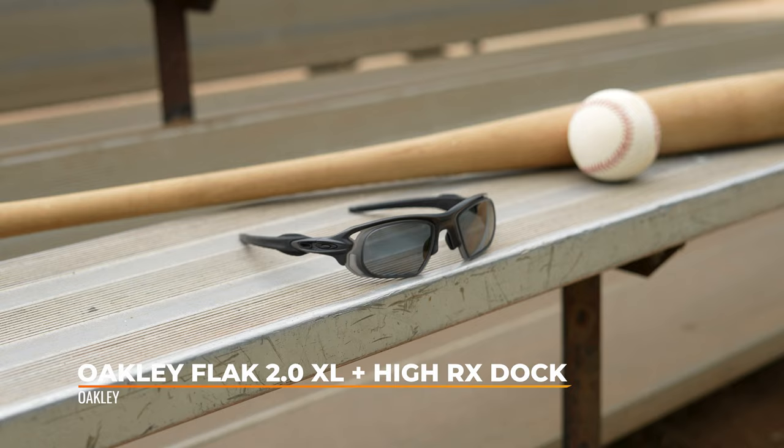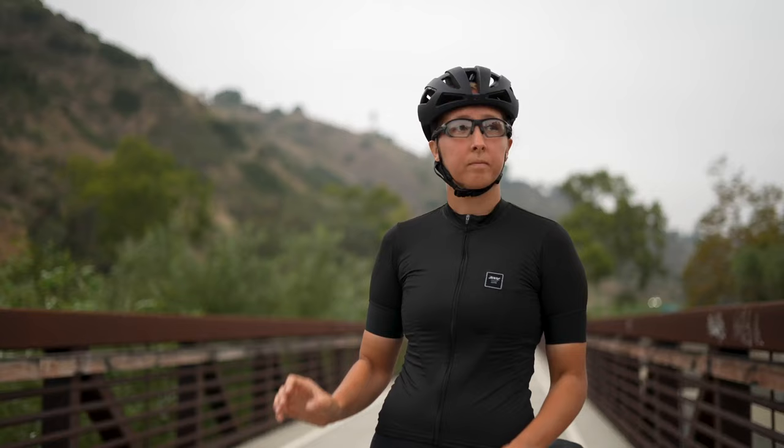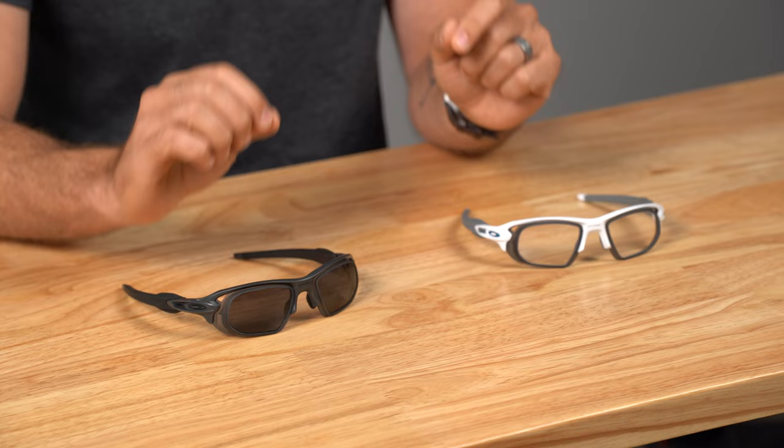Now, if you're familiar with our content, then you know we've hailed the Oakley Flak 2.0 XL as quite possibly the best sports frame design of all time. And there's a reason it's been around for so many years and continues to set the standard for what athletes look for in modern performance eyewear. However, in our 25 years of making the best prescription lenses for athletes of all types, the only limiting factor of the Flak 2.0 XL up until now has to do with the range of prescription strengths of which it can accommodate.